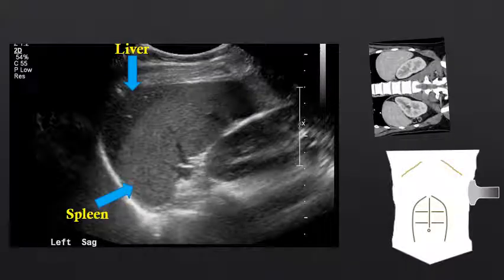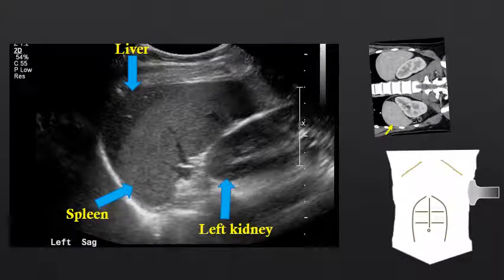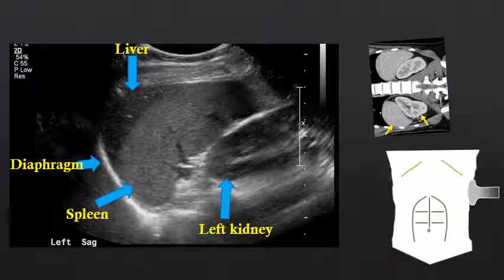We also see the spleen as this large organ in the left upper quadrant of the abdomen. Adjacent to the spleen, we can see the left kidney. Note the left kidney is hypoechoic to the spleen, and this is its normal relative echogenicity — the left kidney should always be hypoechoic to the spleen. Note we can see the diaphragm very clearly in this patient along the superior margin of the spleen and the liver.